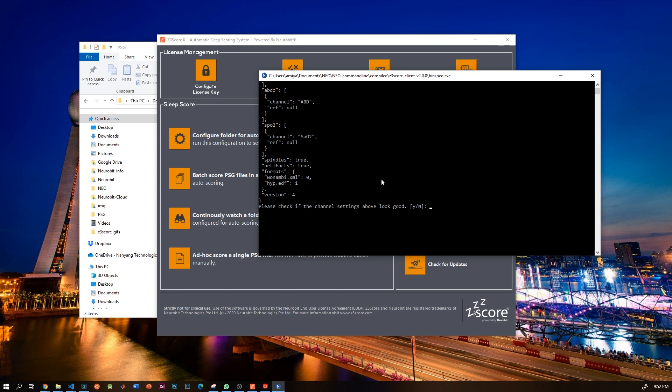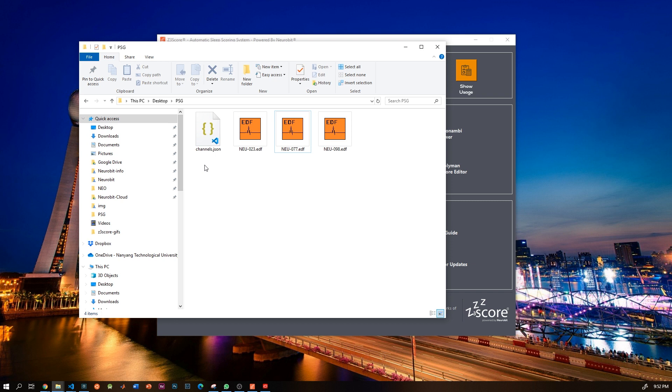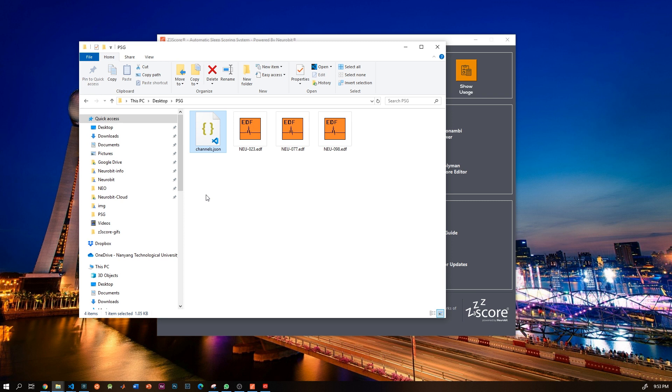So now the channel settings are saved in the folder with the name channels.json. Once the file is there, that folder is now ready for auto-scoring. You can of course edit this document in notepad, or you can actually rerun the channel configuration again from z3score anytime you want. Once you are done with the configuration, scoring is actually very easy.